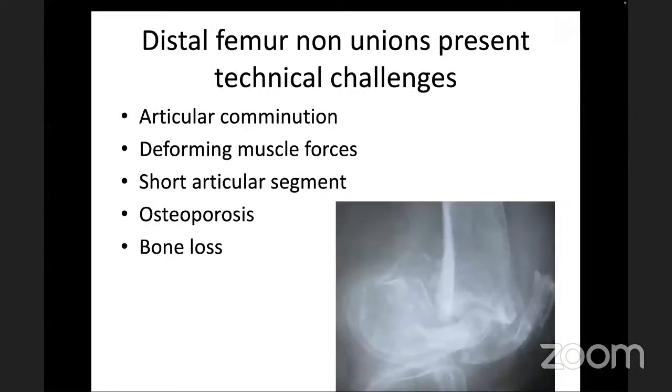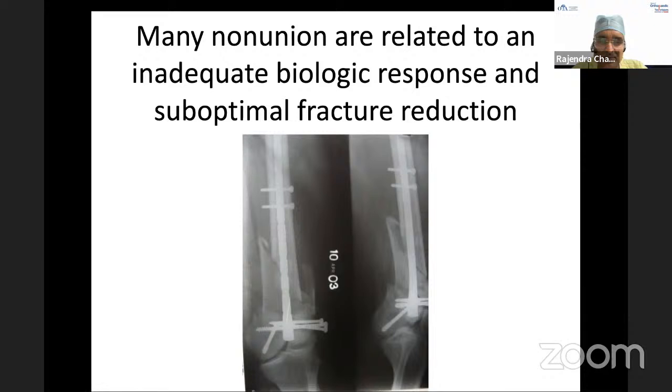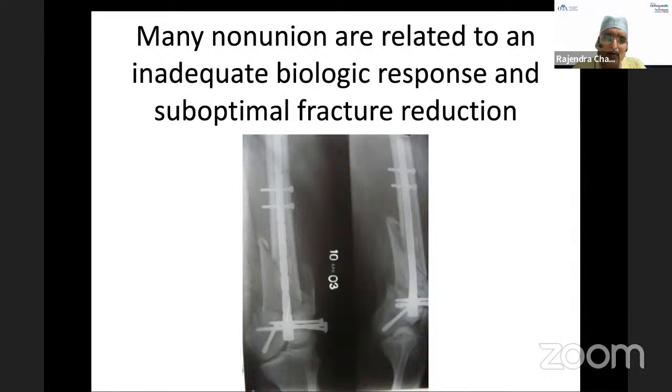Distal non-union. Yes, sir. This particular case. If you were the operating surgeon, would you have added a plate right on the spot? Yes, on day one, I would have added this plate. And obviously, to me, the reduction also is not good. The choice of implant was also not good. The size of the nail was also not good. So I think this was suboptimal in all manners. So I would have added a plate, definitely. If I had selected an intramedullary nail for the distal femur, I would have added a plate and given the length. That would have given everything. And as sir suggests, a dual fixation modality would have given everything for this patient.